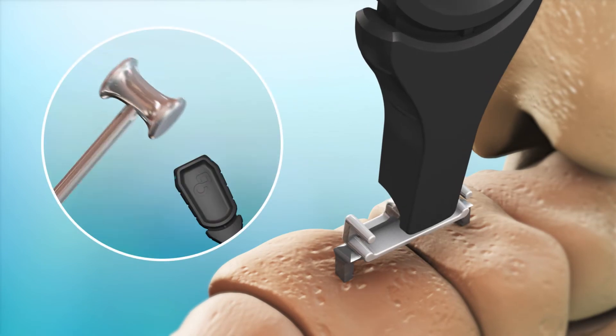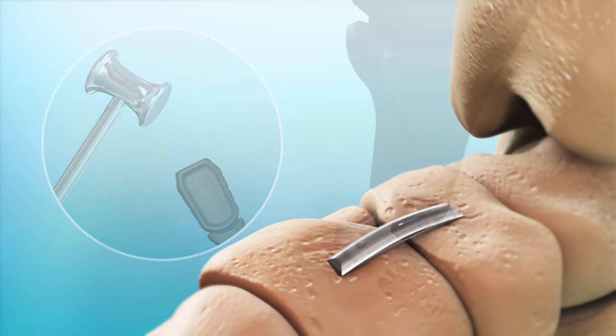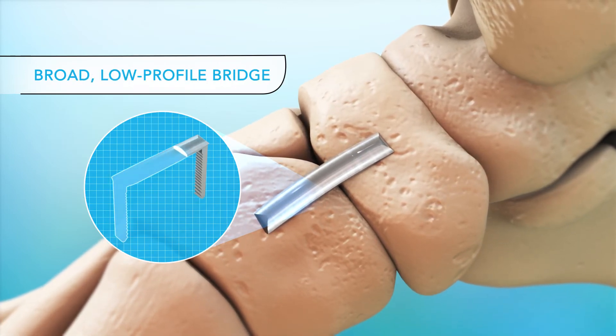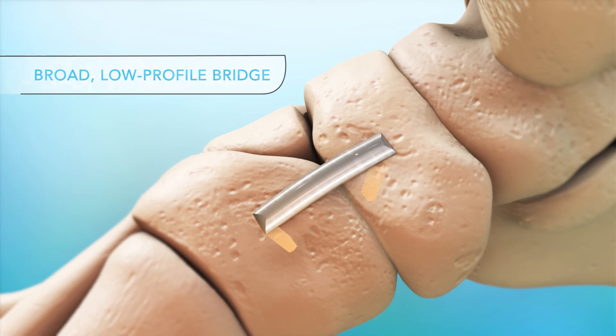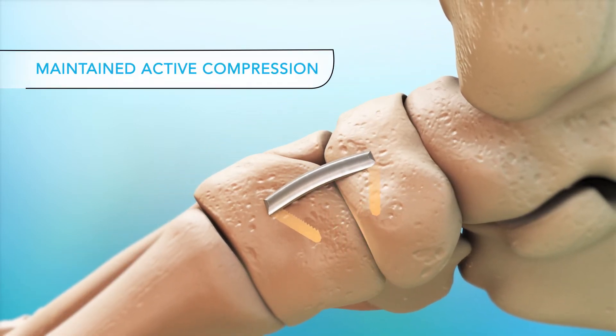Next, use the built-in TAMP to seat the Dynaclip flush with the bone. The Dynaclip features a low-profile cross-section and broad rounded bridge that allows for comfortable, reliable fixation and superior maintained active compression during healing.